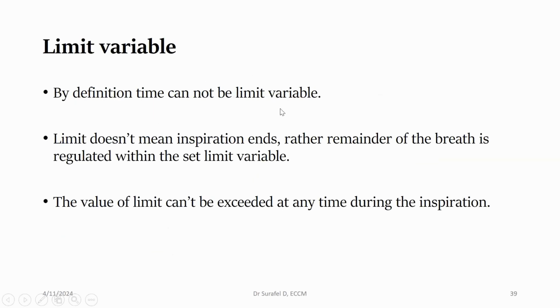Limit and cycle are different concepts. By definition, time cannot be a limit variable. If we set time as a limit variable, you are harming the patient. If you tell the machine to give a breath for, let's say, 4 seconds, it doesn't care about the patient, whether the patient is already exhaling, whether the patient is having significant pressure in his airways.